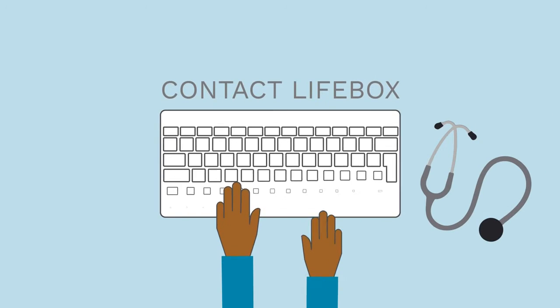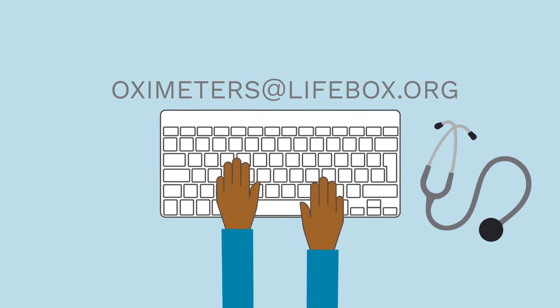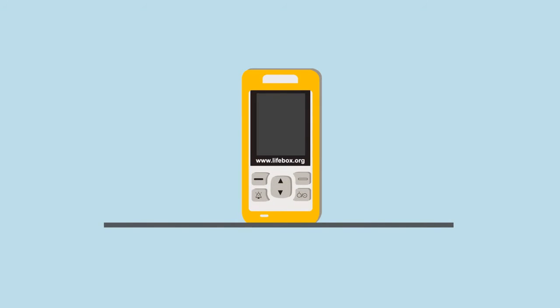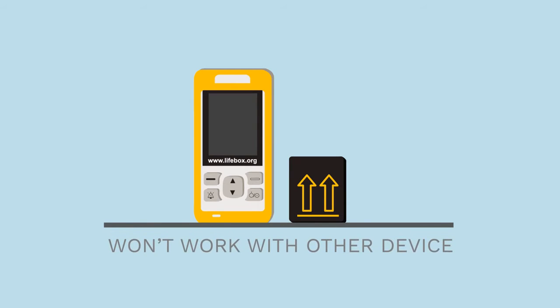If any pieces of the equipment are missing or broken, contact Lifebox immediately by emailing oximeters@lifebox.org. Now that we know what's included in a Lifebox, let's take a look at the steps involved in setting it up. Now, the first thing you might recall is that the Lifebox oximeter is run off a rechargeable battery. It's specially designed to fit the Lifebox oximeter, so it won't work with any other device.